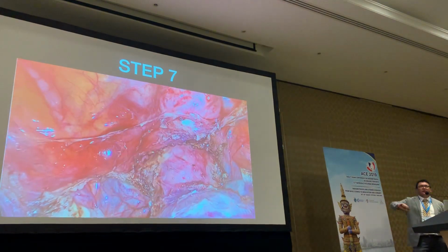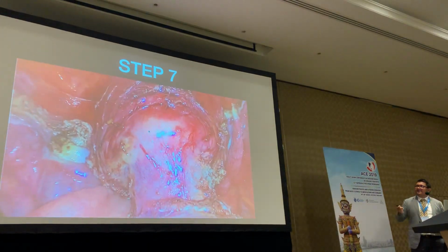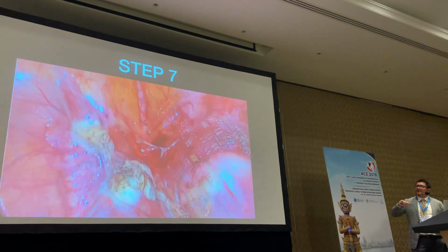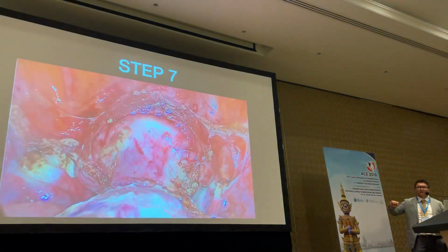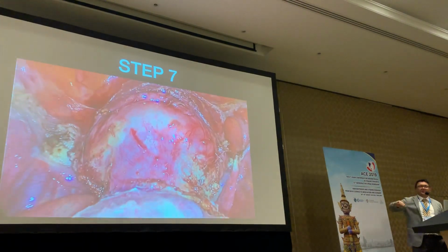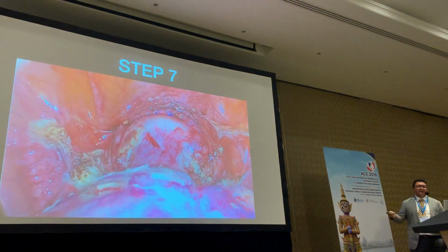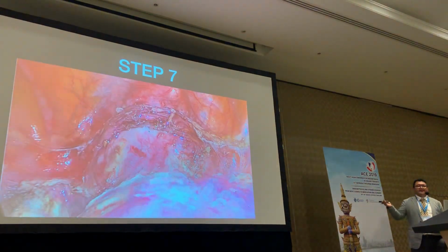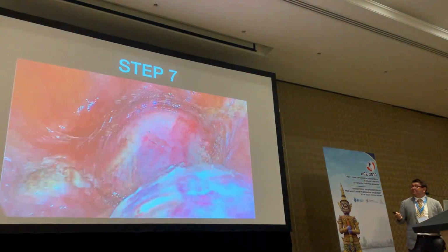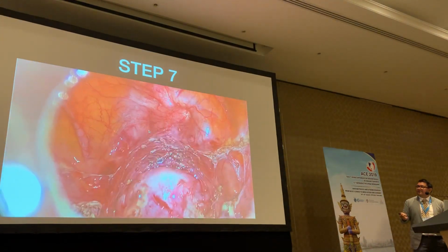So now is when the cup is introduced. I don't introduce it during the beginning of the case. After the bladder is dissected down, this is when we introduce the cup. And the fundus is being pushed cephalad, the cervix is being pushed by the tenaculum grasper of the uterine manipulator, and the cup is on full stretch to try and conserve as much of the vagina as possible. These are women who have a benign hysterectomy. You don't want to do any radical procedure by taking off vaginal tissue. So you try to save as much of vagina as possible.